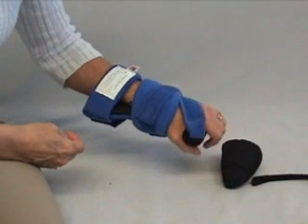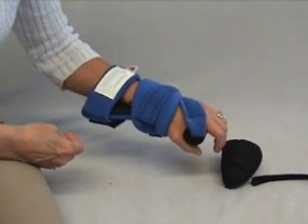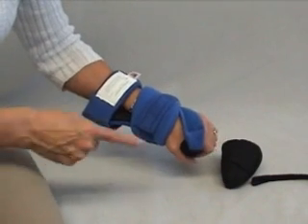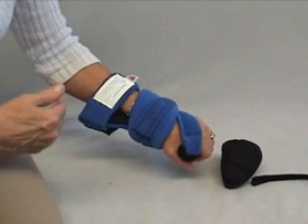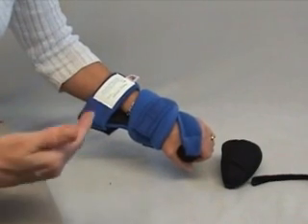Once you get to the stage where you're open enough, you could even — if the patient has potential — go into the thumbies or the restorative hand. You always want to think: continue to restore.